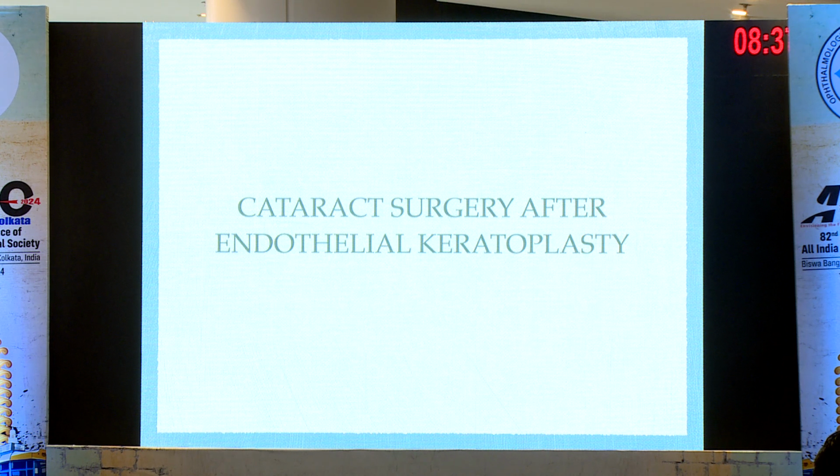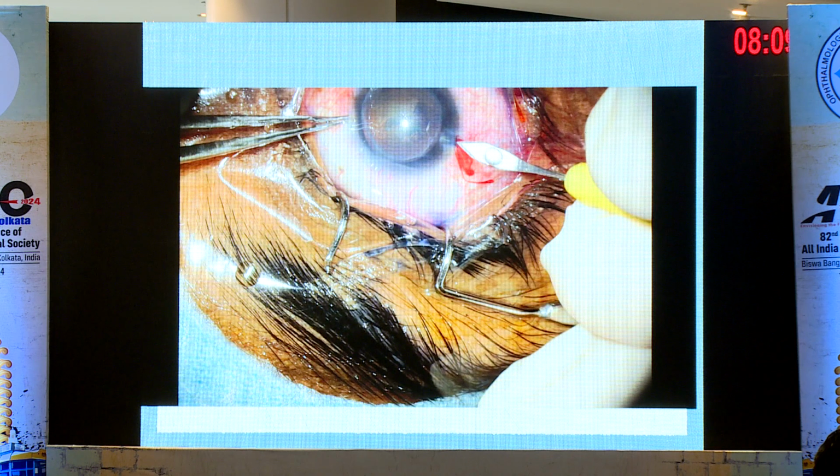Ideally, you would like to make your entry outside the DMEK graft, but I don't think it's mandatory. It's very unlikely that your phacoemulsification will detach the DMEK graft. Rest of the surgery is pretty much normal. Even for IOL calculation in DMEK, you don't really need to make much of an adjustment because the DMEK graft doesn't have much of a refractive effect, unlike the DSEK graft, which causes a hyperopic shift, so you have to choose a more myopic power.